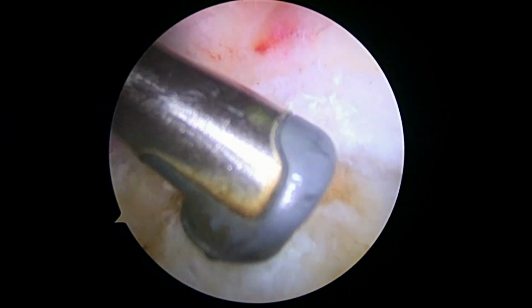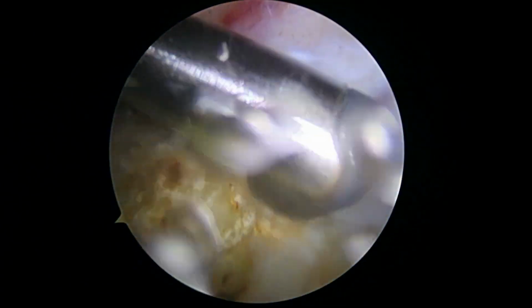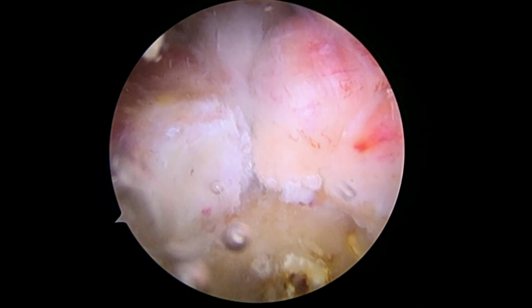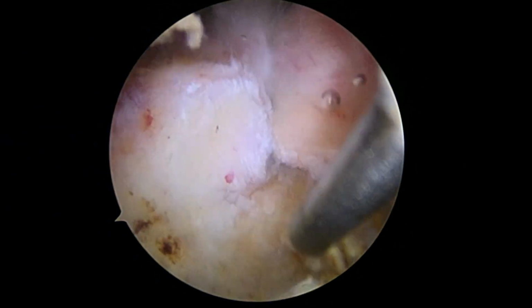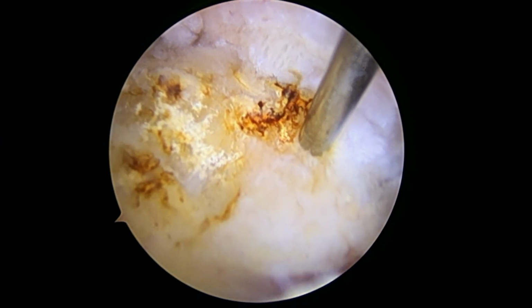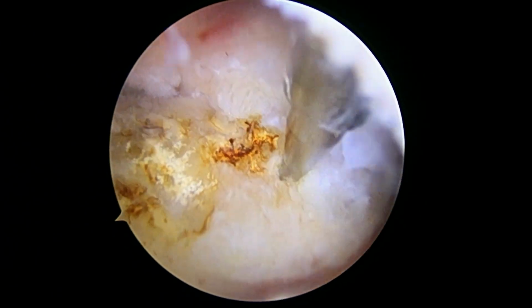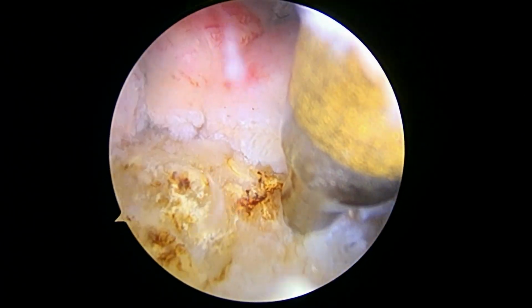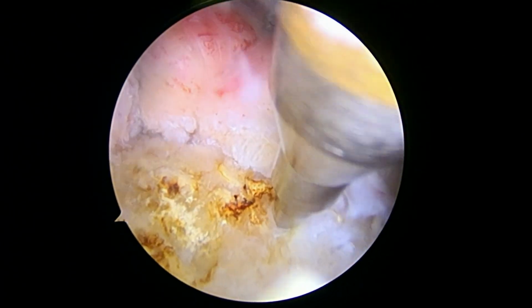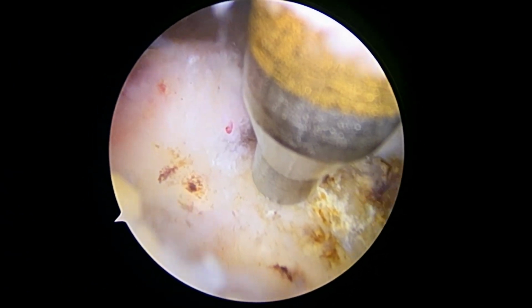See how we've got this open space here? We're going to make some little holes in the bone. I'm sure we're down to the bone. Yeah, so we're going to make some little holes in the bone right here. Grab a mallet. Okay, and so with this size tear, we'll make a hole right here. Go ahead. Keep going. See that shoulder? Keep going. Yep, right there. So there's one hole. And then we'll make another one over here. Go for it. Great. Okay, and so that's our final trick.